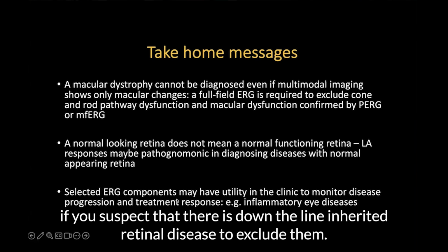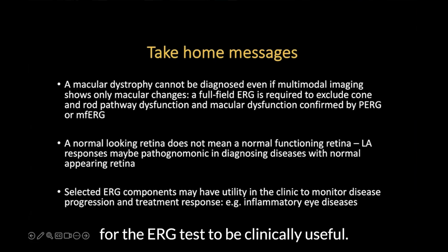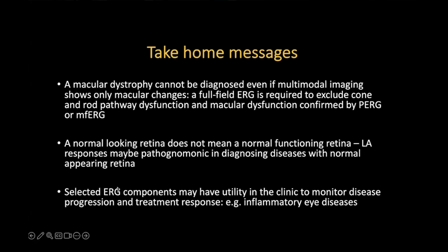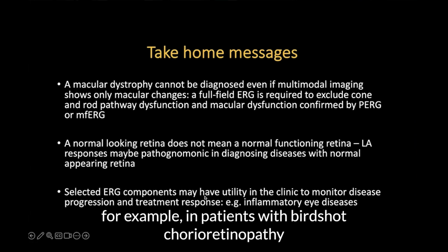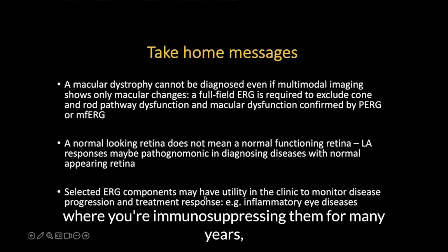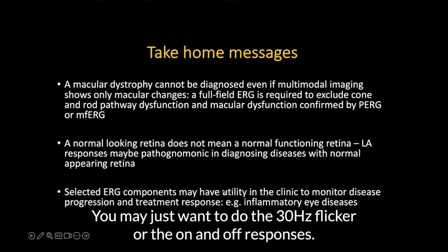And finally, not all patients have to go through 3 hours of testing for the ERG test to be clinically useful. In some situations, particularly posterior uveitis, selected ERG testing may be useful. For example, in patients with birdshot chorioretinopathy, where you're immunosuppressing them for many years, you want to know whether that is useful or halting the disease process. You may just want to do the 30 Hertz flicker or the on and off responses.